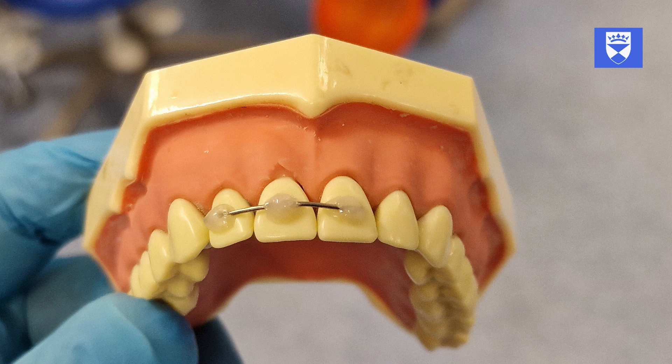There should be no sharp edges, and the ends of the wire should be firmly embedded within the composite.